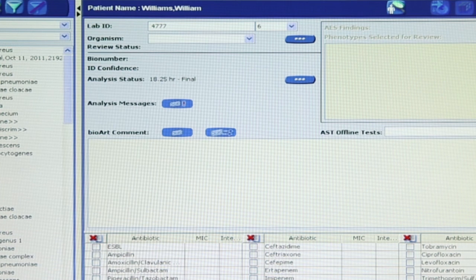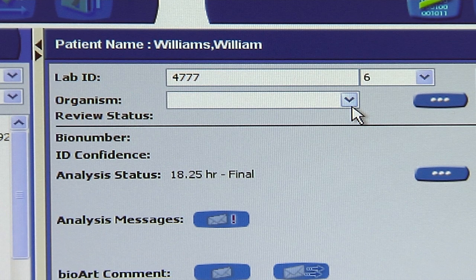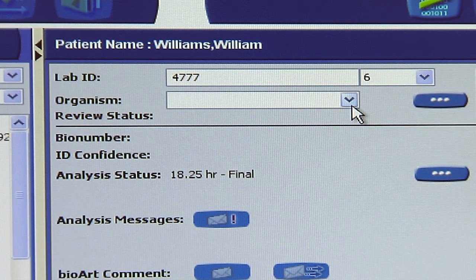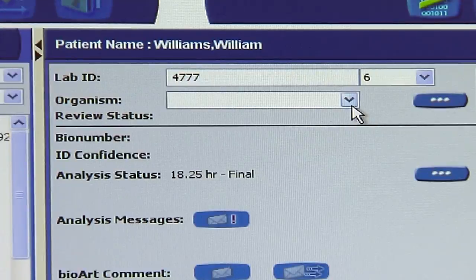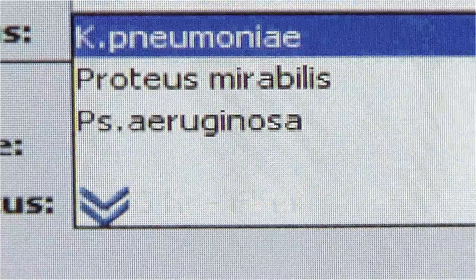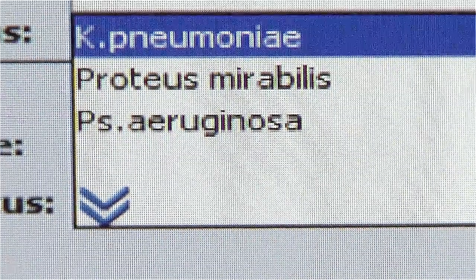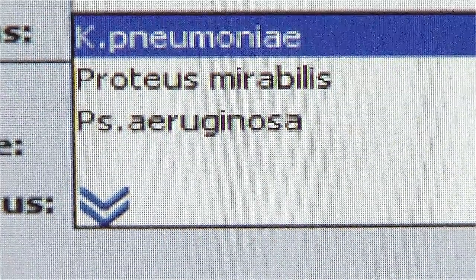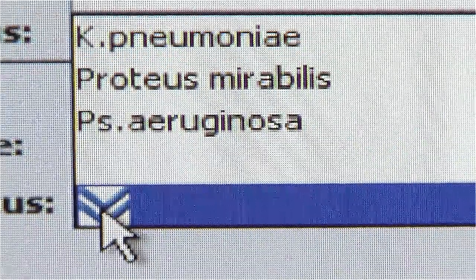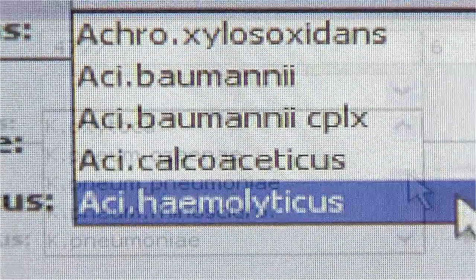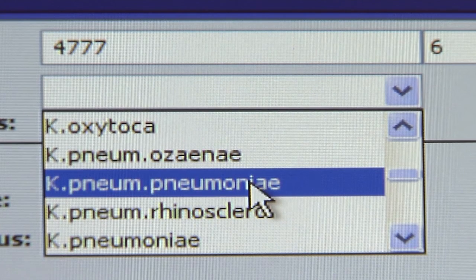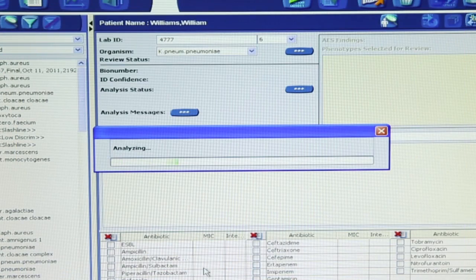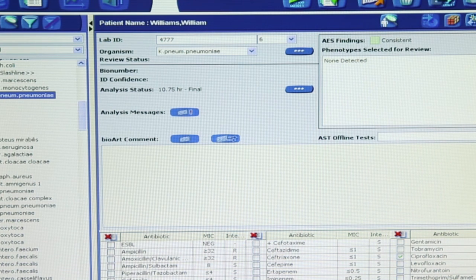Let's start by looking at issues related to ID analysis. First, is the organism field empty? If the organism field is blank, it generally means that an identification performed by an alternate method was not entered at the time the test card was set up. Click in the organism field to display the drop-down list of organisms. The most common organisms are listed first; other organisms are accessed by clicking the blue down arrows. Click and select the appropriate organism. The software will analyze the results automatically once the organism name is selected.